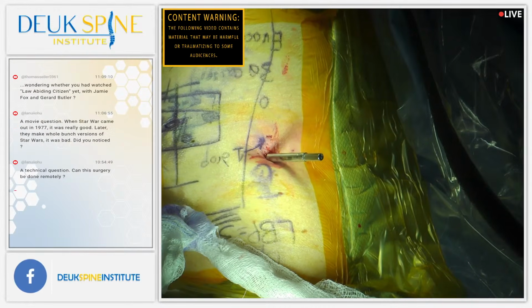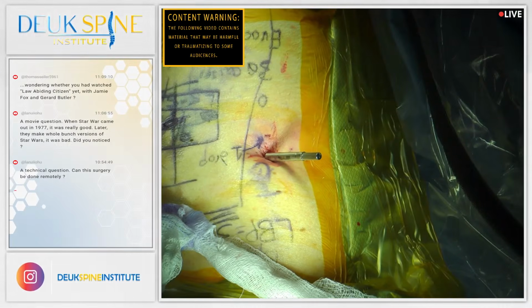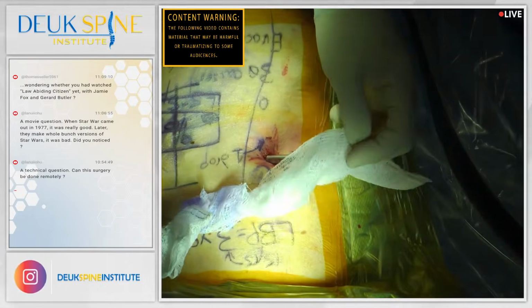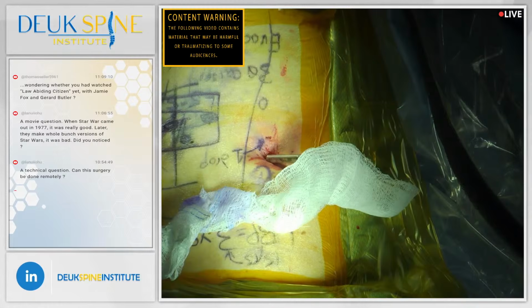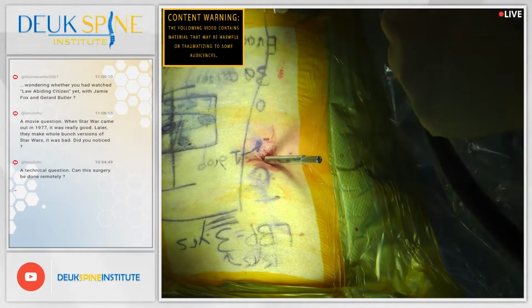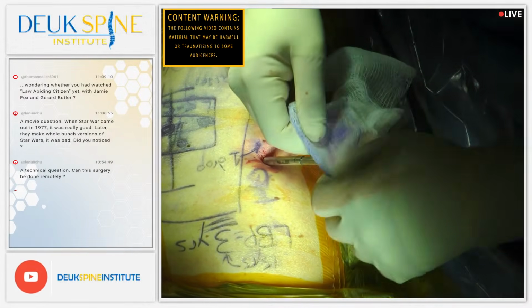Give Berndes one more chance to get him a little deeper, and then before you use the vice grip. The vice grip will destroy the dilator. We don't want to do that if we don't absolutely have to.